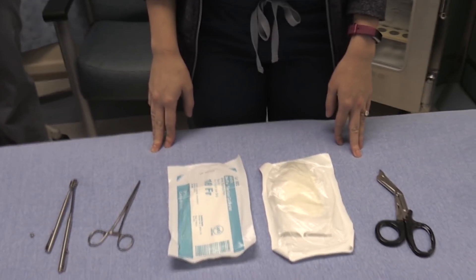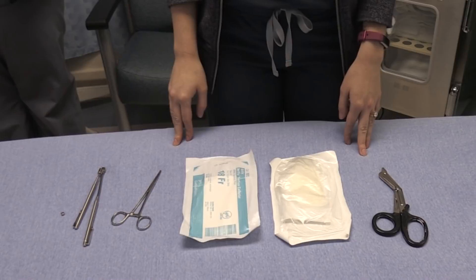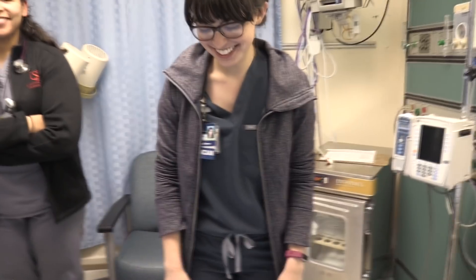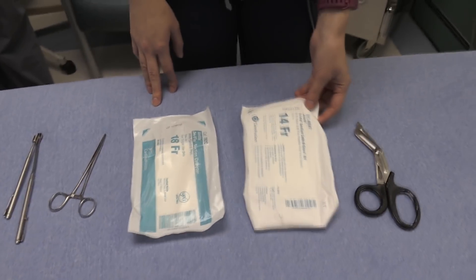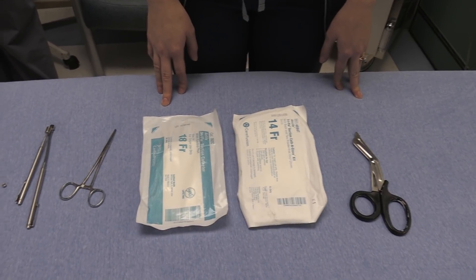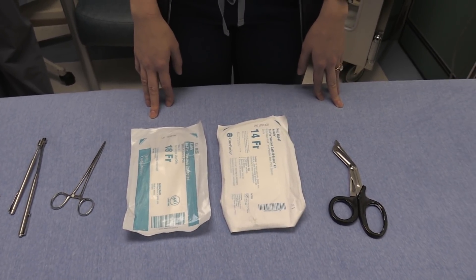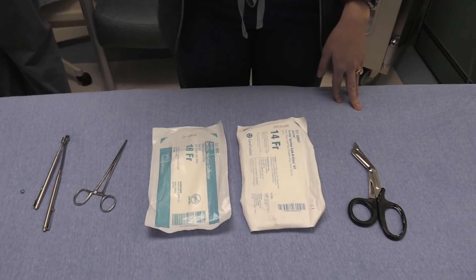What we're going to do today is try out a suction catheter for removing a foreign body from the ear. I've got a couple of candidates who are going to participate in this. The foreign body is going to be a little hearing aid battery. We have a backup — we have magnets in case this doesn't work. We want to do either a 14 or an 18 French, and we're going to see if we can create a suction catheter that will pull a foreign body out of the ear.